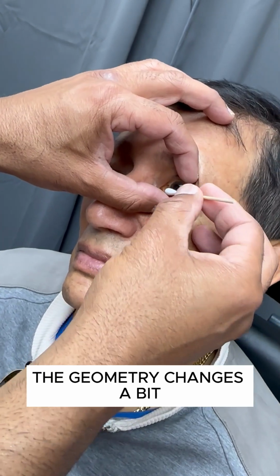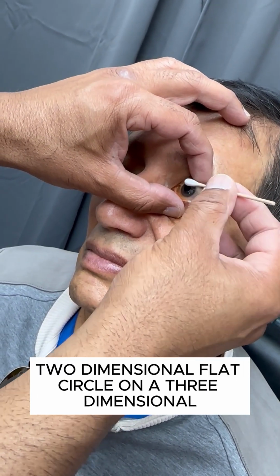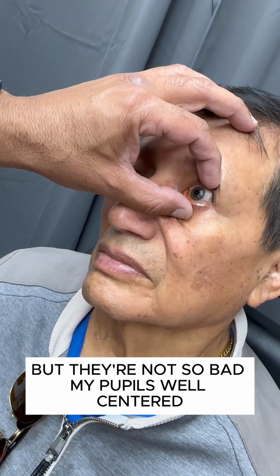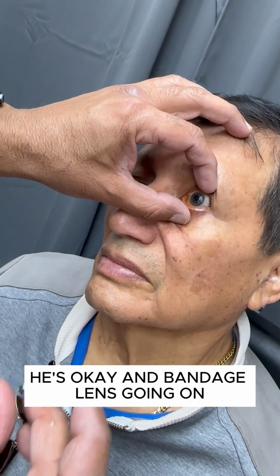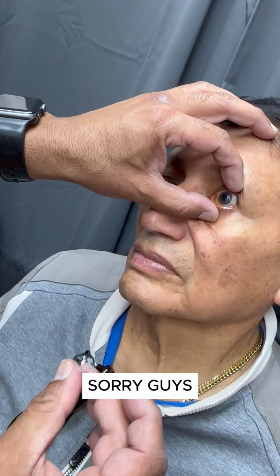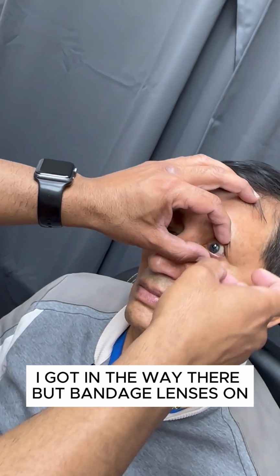Of course, the geometry changes a bit. You're putting a two-dimensional flat circle on a three-dimensional curved surface. There will be some folds, but they're not so bad. Our pupil's well centered. He's okay. And bandage lens going on. Sorry guys. Bandage lens going on. I got in the way there, but bandage lens is on.